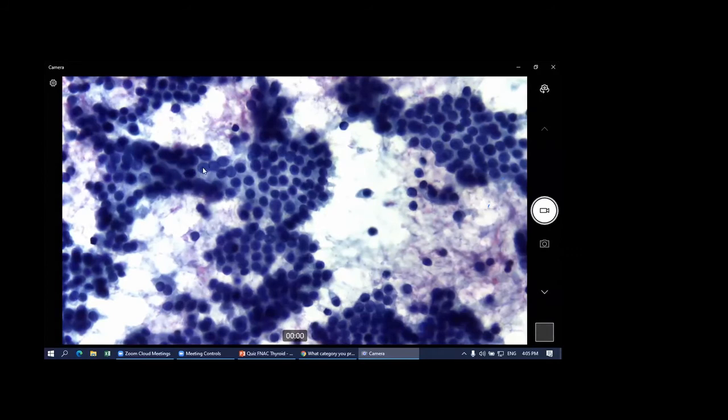Right. There's not much of nuclear pleomorphism. It's rather still similar looking. It does not have any nuclear feature. But some of it appears like clearing, but it is not the optical clearing that you usually see for papillary thyroid carcinoma. Let me bring you to another area that is a bit less busy.